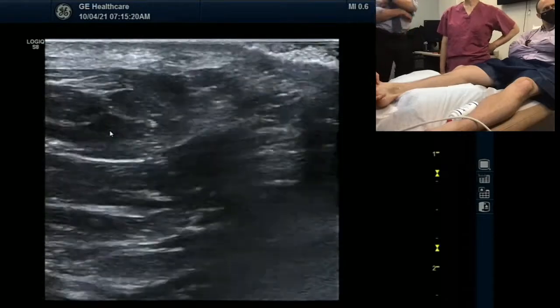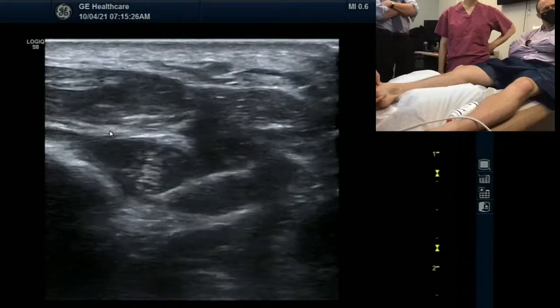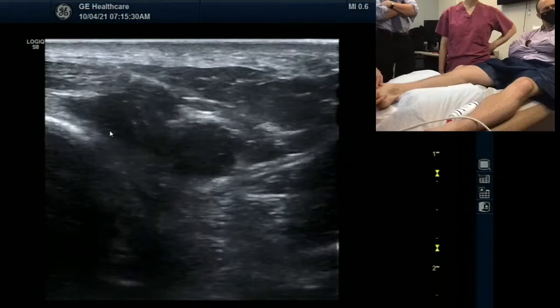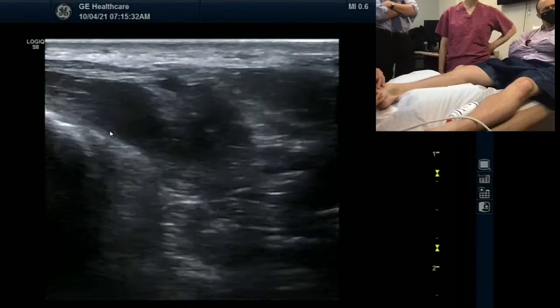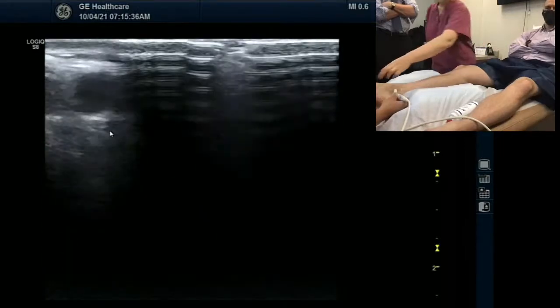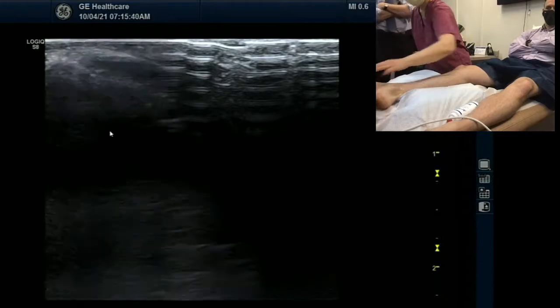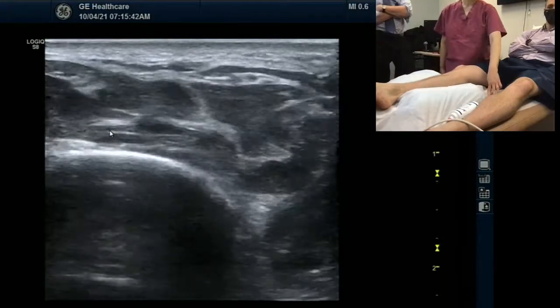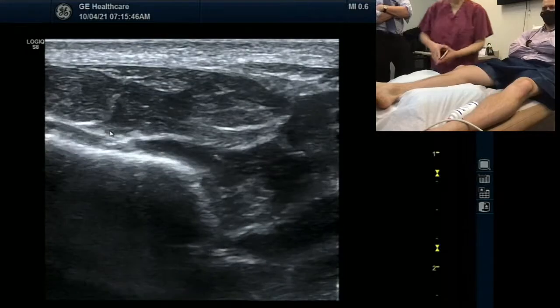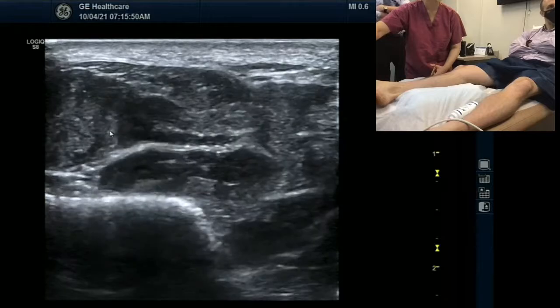Since we don't know the foot muscles as well, I've been trying to learn it. And it's something I don't see a lot of literature on. It's there — we just got to search for it. Have him activated. I like this — but this is the abductor hallucis. And it's like the hallucis brevis. Can we just go over the foot muscles? So I assume this is an abductor. Let's see — can you abduct? Abductor hallucis.